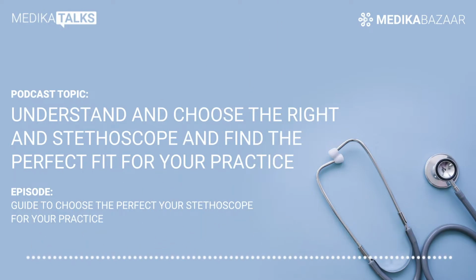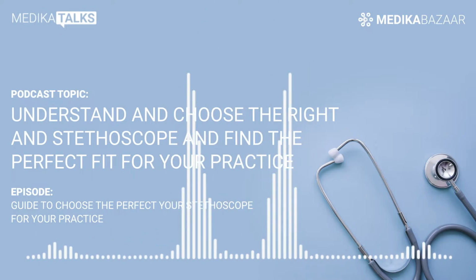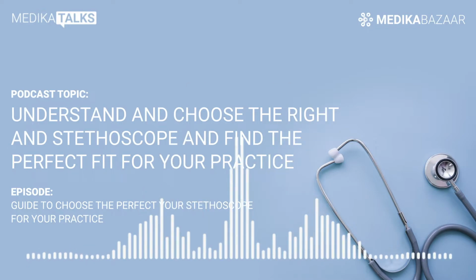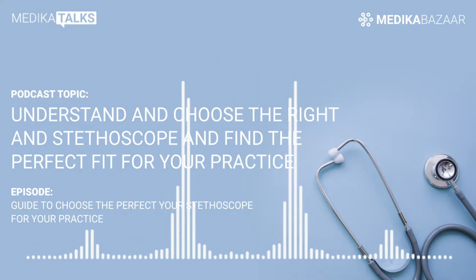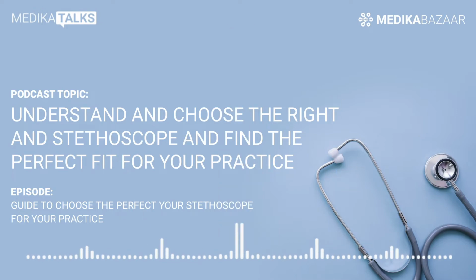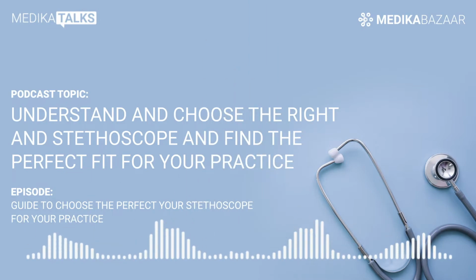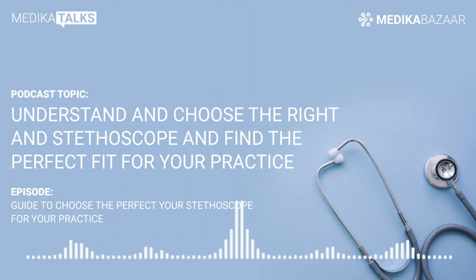disease they treat. General practitioners use their stethoscope daily for listening to cardiac and pulmonary functions in patients of all ages. Most general practitioners opt for a dual head model in order to be able to examine all patients with the same instrument. Pediatricians. Since pediatricians only treat children, they use a specific model, differing from an adult model mainly by the size of the head.